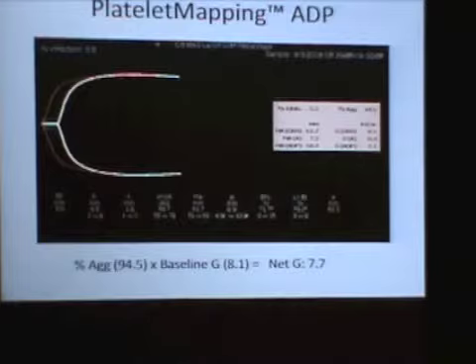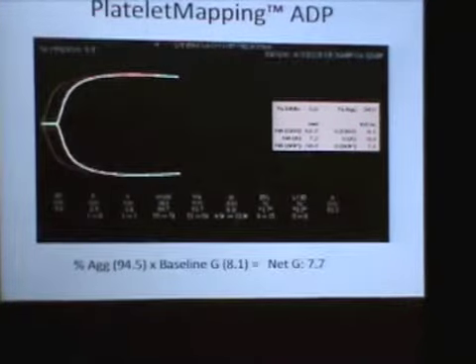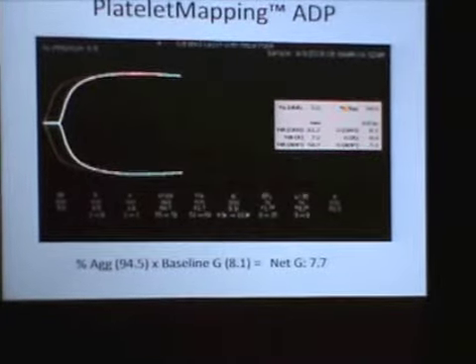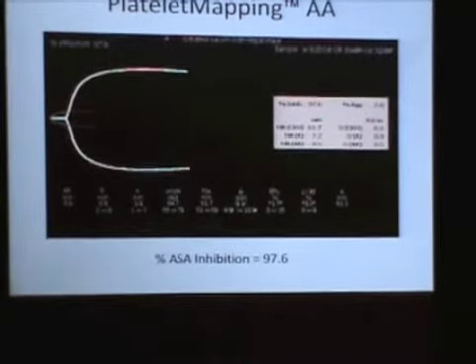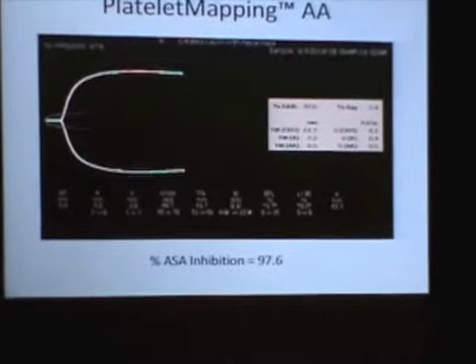Okay, we did platelet mapping. This patient was on Plavix, right? No Plavix effect. See, 94%, 95% still functional on the platelets. Okay, so the Plavix they were on is not working. Is the aspirin working? Oh, yeah. Yeah, 98% inhibited from aspirin.